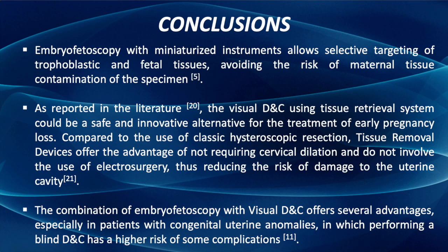Embryofetoscopy with miniaturized instruments allows selective targeting of trophoblastic and fetal tissue, avoiding the risk of maternal tissue contamination of the specimen. As reported in the literature, the visual DNC using a tissue retrieval system is a safe and innovative alternative for the treatment of early pregnancy loss. Compared to hysteroscopic resection, tissue retrieval devices offer the advantage of not requiring cervical dilation and not involving the use of electrosurgery, thus reducing damage to the uterine cavity. The combination of embryofetoscopy with visual DNC offers several advantages, especially in patients with congenital uterine anomalies in which performing a blind DNC has a higher risk of complications.